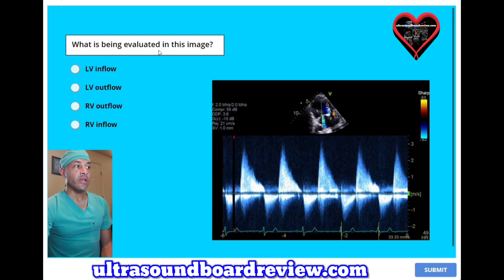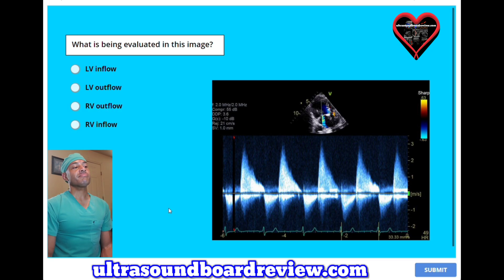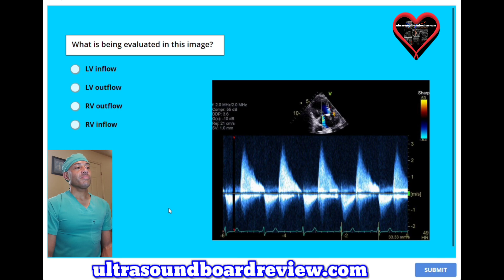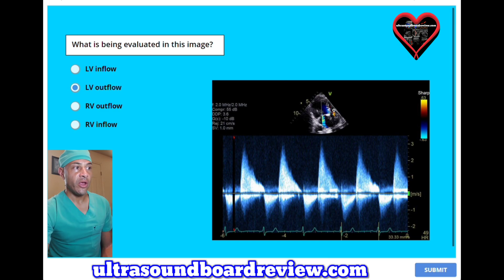What is being evaluated in this image? A, LV inflow. B, LV outflow. C, RV outflow. Or D, RV inflow. The answer is B, LV outflow. You can see that the cursor here is going through the aortic valve.